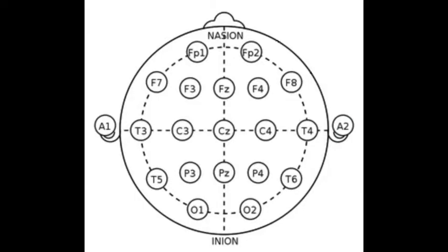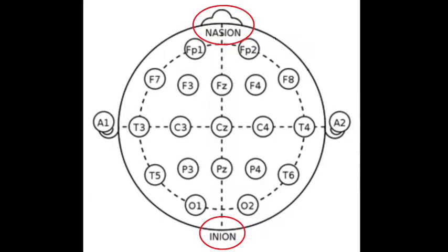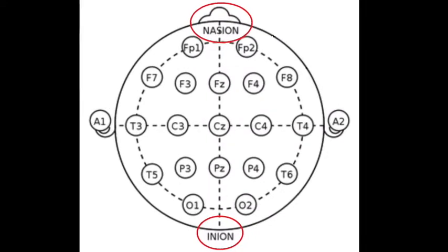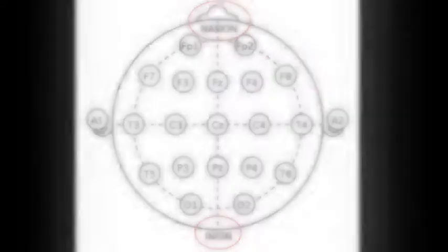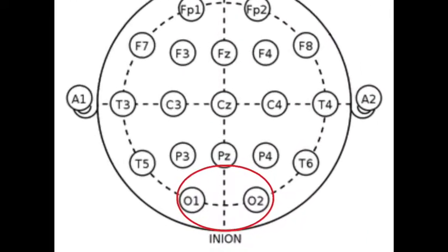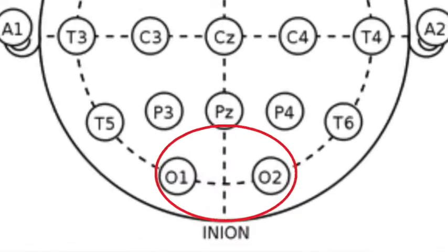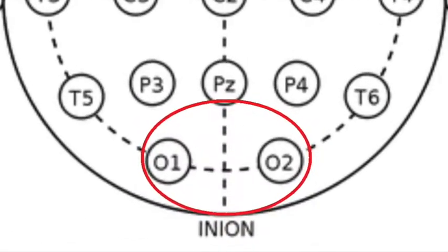For the placement of these 10 electrodes, we use the 10-20 system. The electrodes are measured and marked 10% from the nasion and 10% from the inion. Only electrodes measuring information required by our algorithm will be wired. The O1 and O2 electrodes are used to measure two different signals, which our algorithm identifies and instructs the device to perform certain functions: SSVEP for controlling lights and alpha rhythm for controlling blinds.